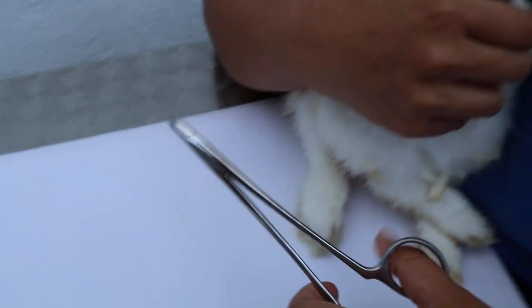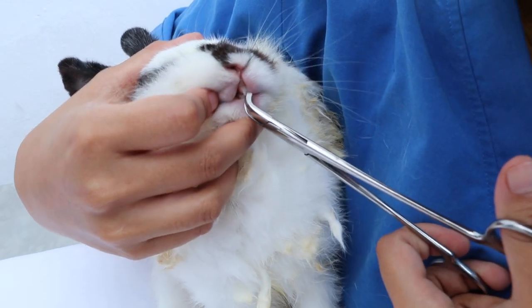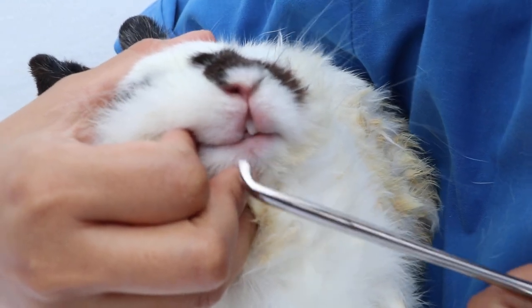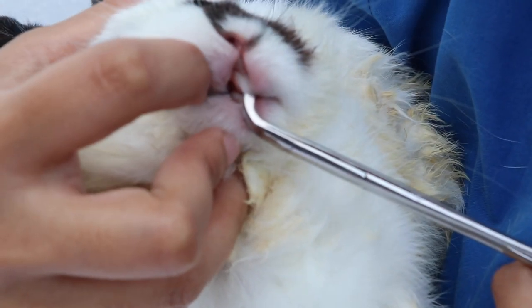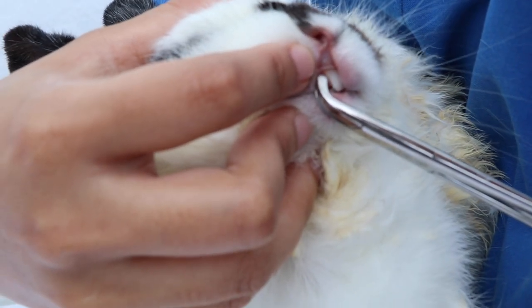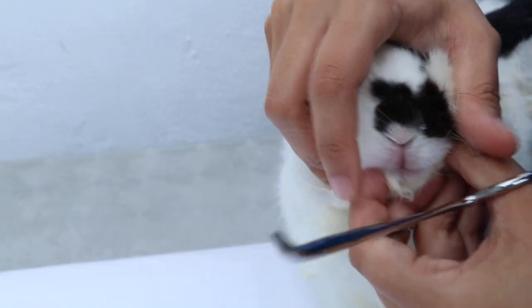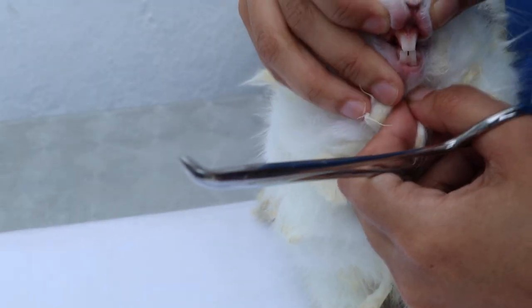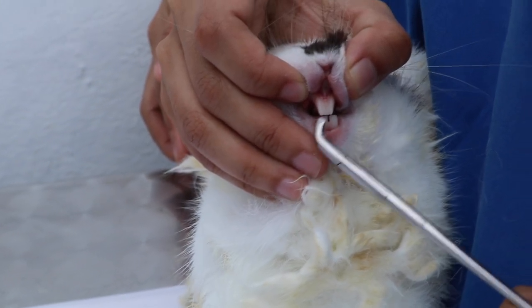The next one is the cheek teeth extraction forceps. After you luxate the teeth and they are loose, you go in and pull out the cheek teeth. It is mainly for the cheek teeth, but can also be used for incisors. The cheek teeth — the molars — are inside, but we cannot demonstrate opening because the rabbit is not sedated.